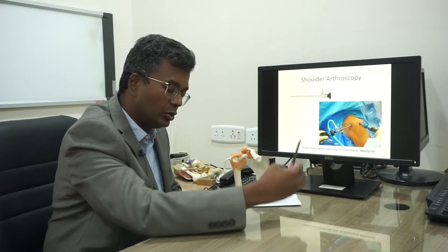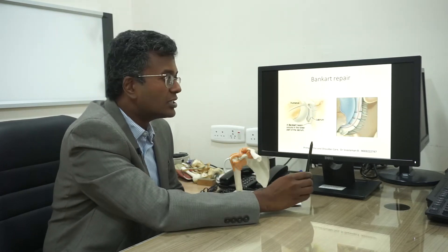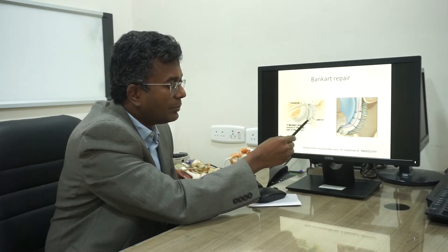We use instruments to go inside the shoulder and perform various surgeries through the keyhole. We'll briefly cover what surgeries can be done with shoulder keyhole surgery. For example, for a patient having recurrent dislocation of the shoulder, we do what is called a labral repair.